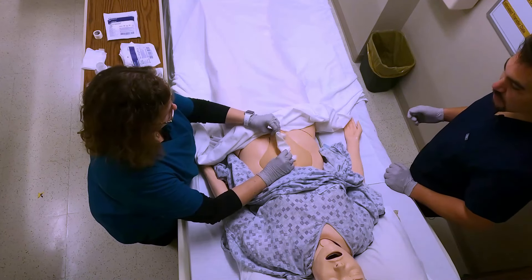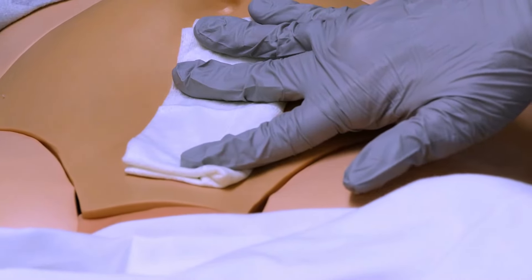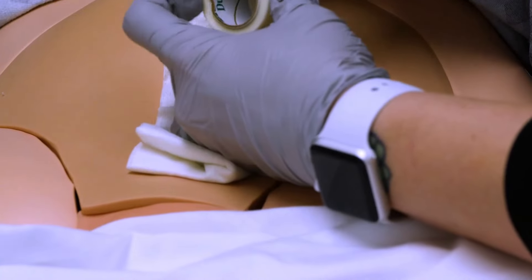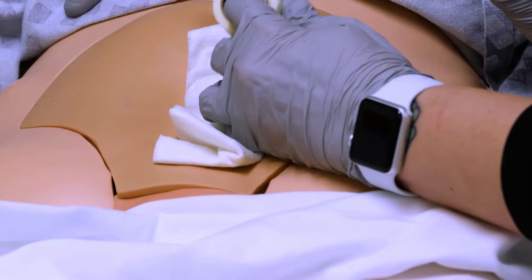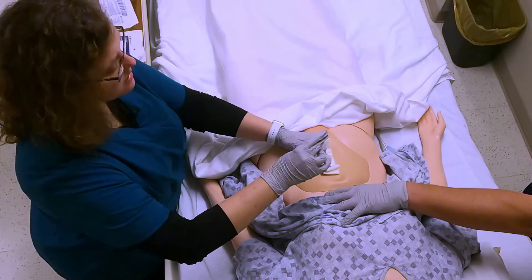I'm just going to make sure that the incision gets covered back up well, and put a little tape on it. If this is a mobile person, I want to tape it down better so they don't lose their dressing in the middle of a walk.